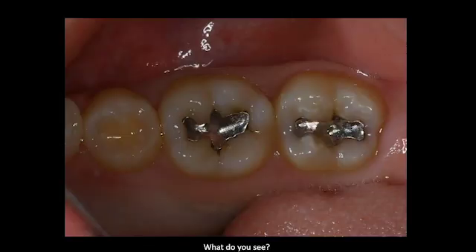This is a composite that's mainly geared towards the posterior portion of the mouth because of the high strength it has. When we look at these restorations, we see that there's some wear on these amalgam restorations — they've been polished because of occlusal forces. We definitely see some margins that are starting to open up and possibly develop recurrent decay. Most importantly, they're unesthetic. A lot of patients present to my practice and say they don't want the mercury in their body and want these restorations removed.